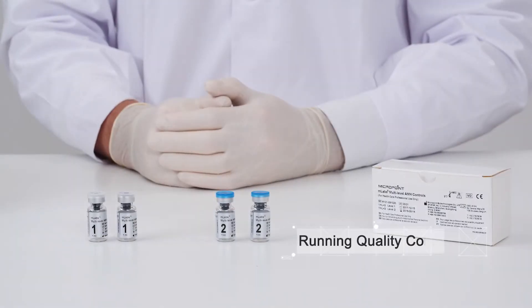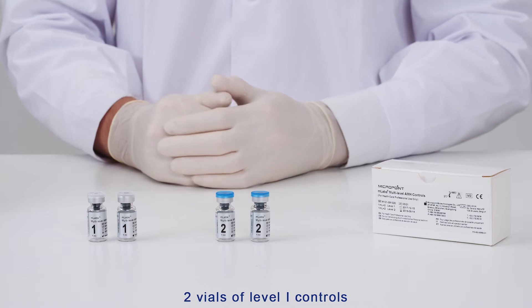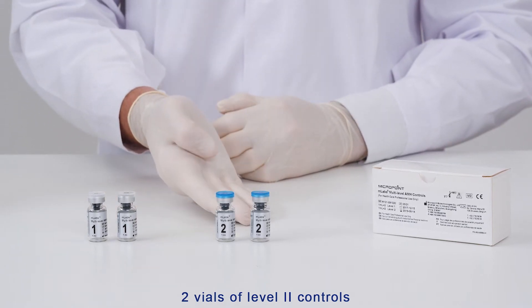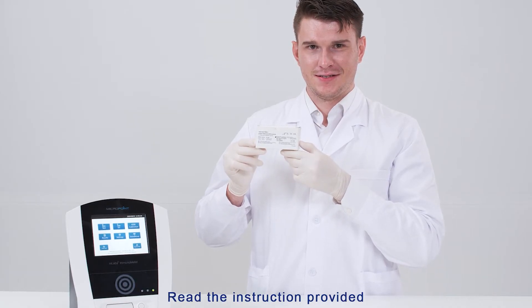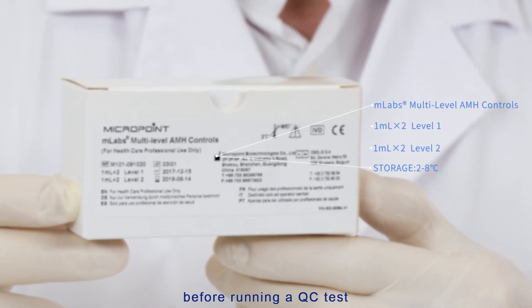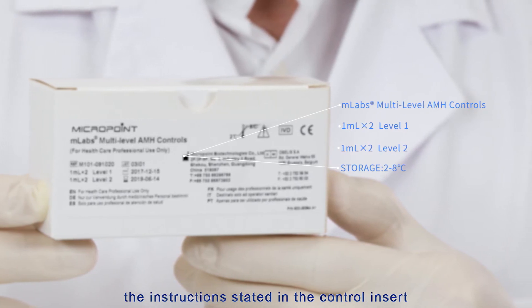For QC pre-installation, the M-Labs AMH multi-level controls include the following materials: two vials of level 1 controls, two vials of level 2 controls, and one product insert. Read the instructions provided with the quality control material carefully before running a QC test. Prepare the cartridge and the QC sample following the instructions stated in the control insert.